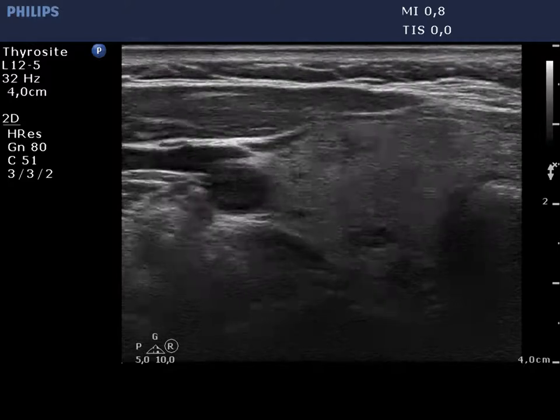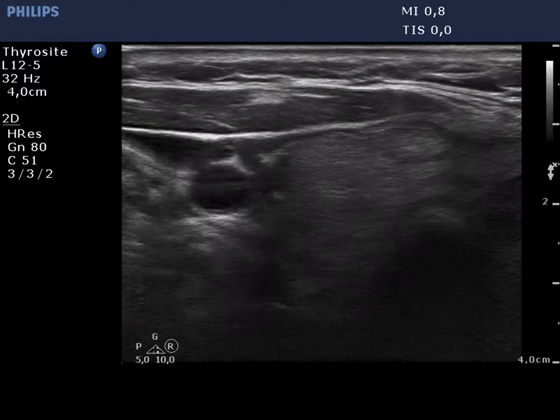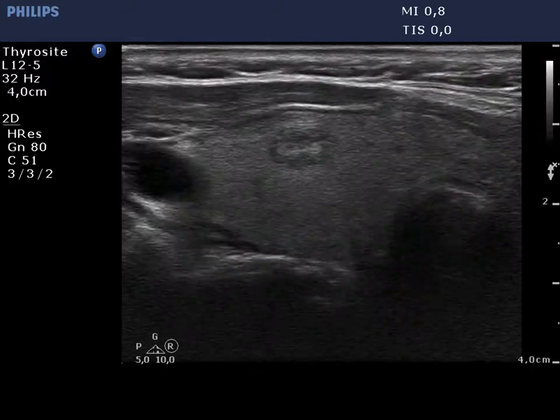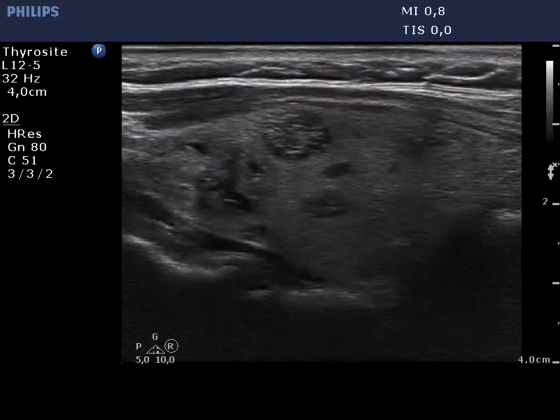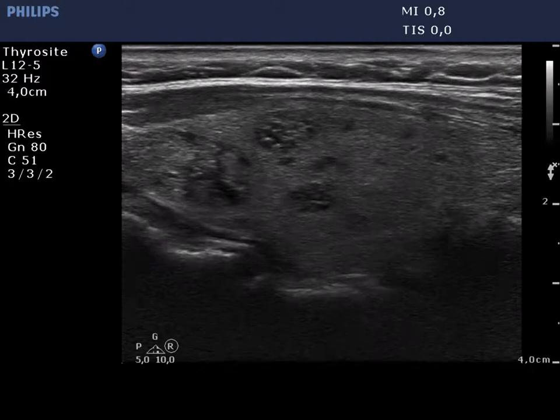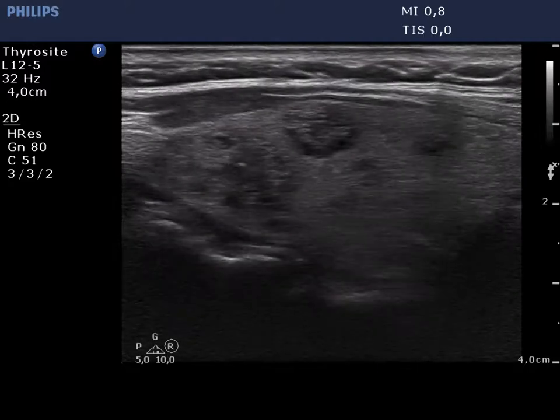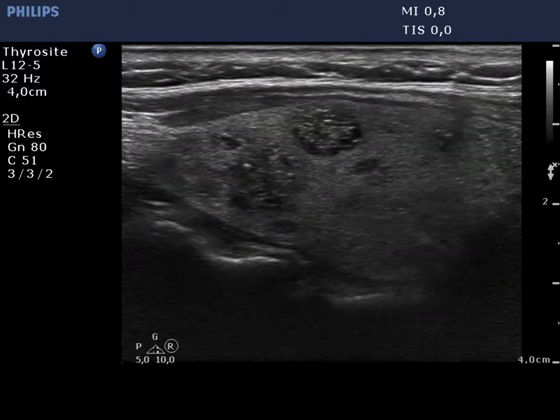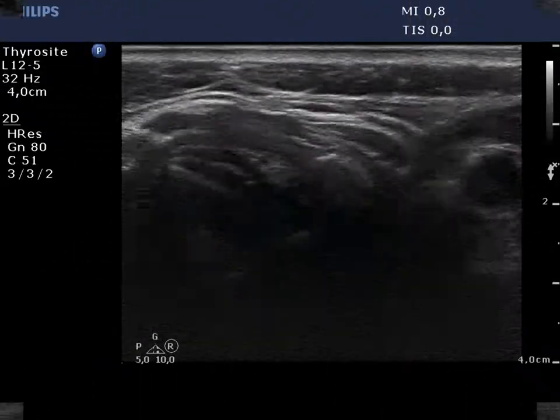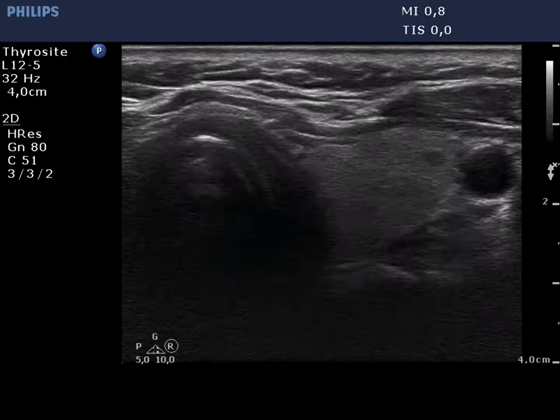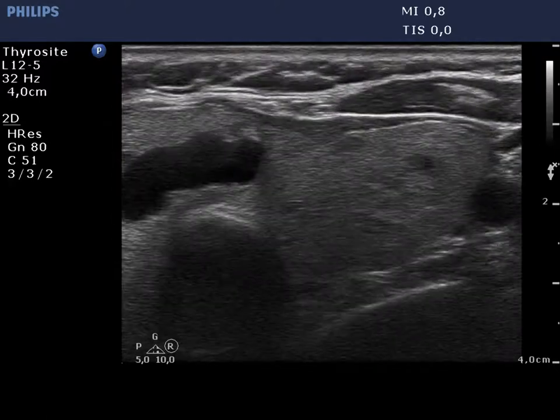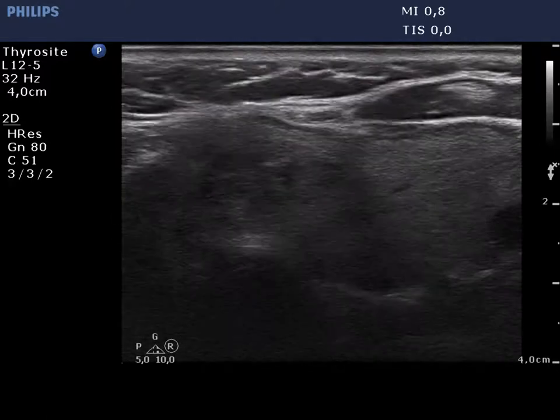The thyroid is isoechoic and contains several hypoechoic and cystic lesions which present various hyperechoic figures. The left lobe has a similar appearance.